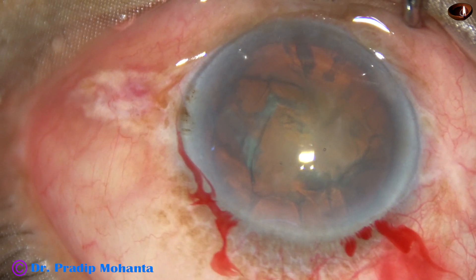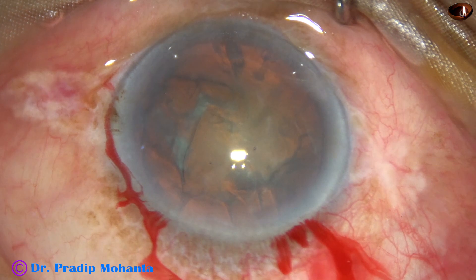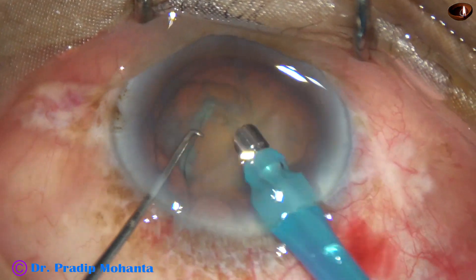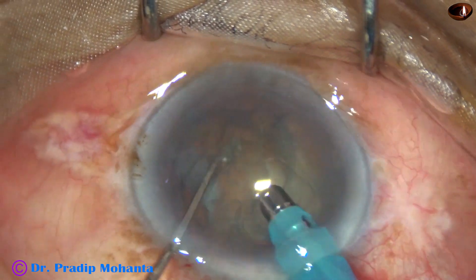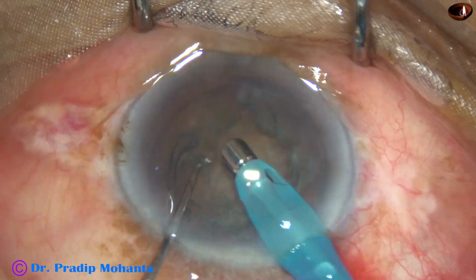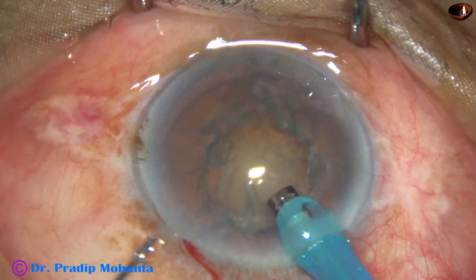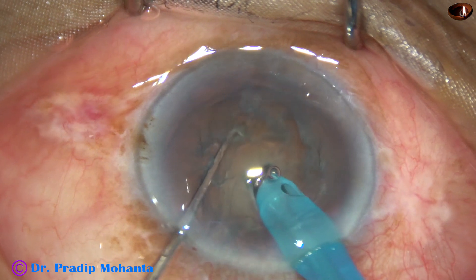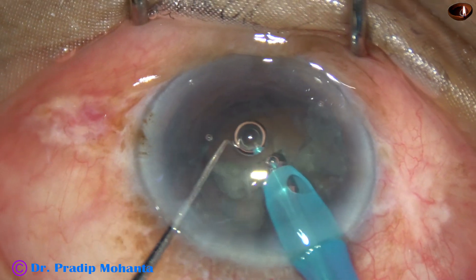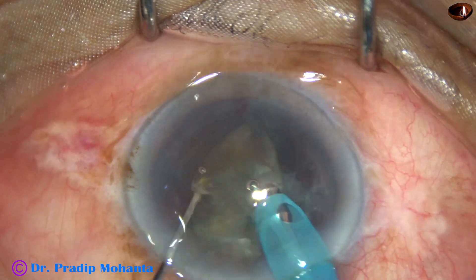All nuclei are usually more than 3.5 millimeters in thickness — usually 4 millimeters, and very hard nuclei maybe even 5 millimeters thick. After removing the superficial cortex, if we just bury the 2.8 millimeter tip into the substance of the nucleus, we go to sufficient depth — about 3 to 3.5 millimeters deep, and that is enough. If we bury the tip completely into the substance of the nucleus, then it is enough.